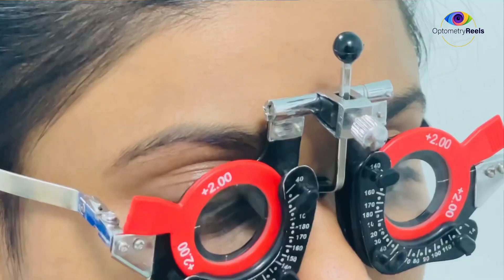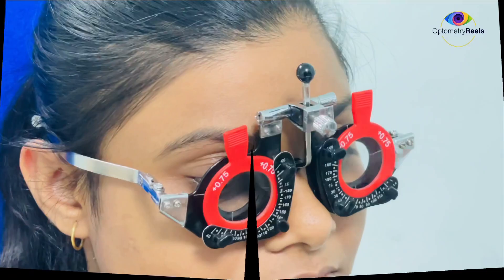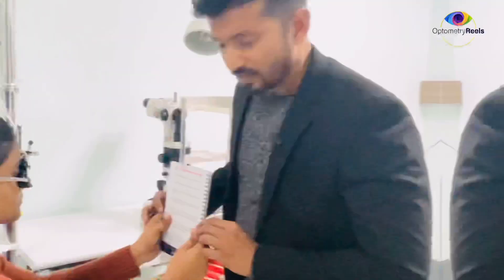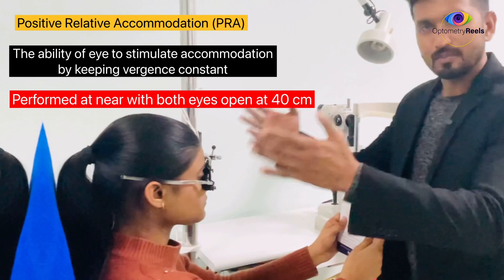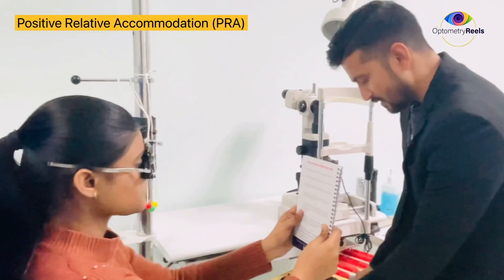The next step is to gradually defog this power. You have to place the next lens before removing the previous one. Next we are going to perform Positive Relative Accommodation (PRA). The target again should be 40 centimeters and the trial frame should be adjusted — the patient has to be fully corrected for the refractive error.